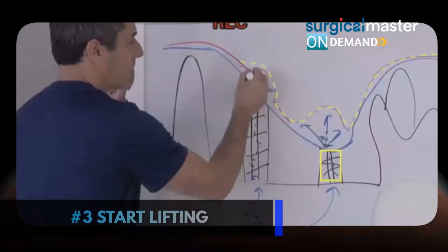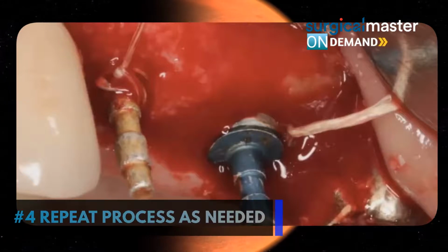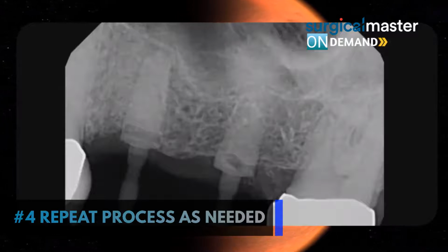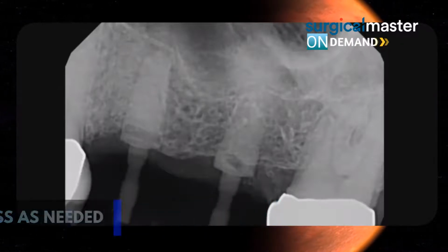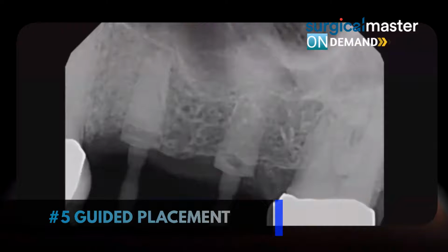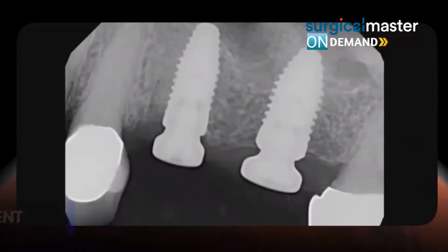Don't start lifting before you widen. And then start the lifting. Get your domes in place. Keep taking x-rays. In sinus lifting, I take a lot of x-rays. I repeat the process as needed. You don't need to lift for 20 millimeters or 13. All you need to have is 10, 11 millimeters of bone height for a molar. You want to have the same level for a premolar. And then you can place the implants at the same time, as long as you have the native bone supporting it. Okay, it's a pretty simple and streamlined process.